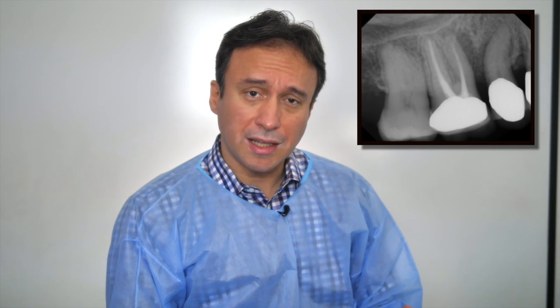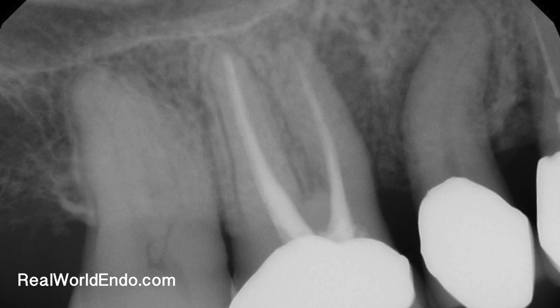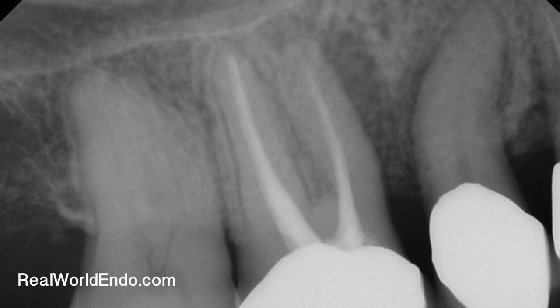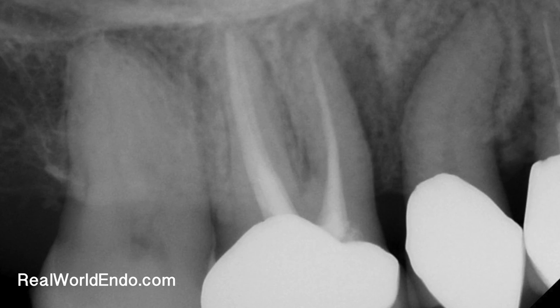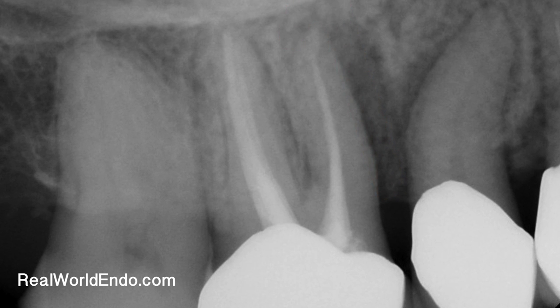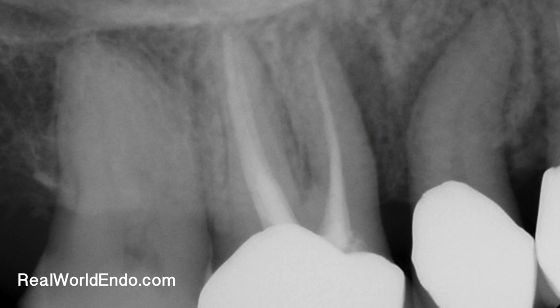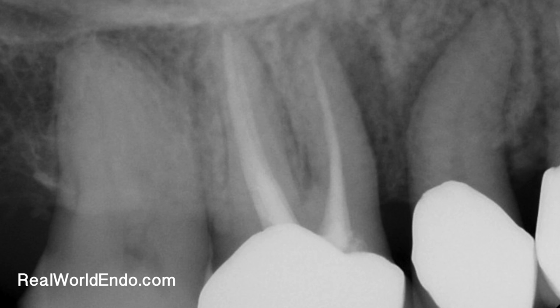Surprisingly, no probing was present when I tested it. No distal buccal and palatal root radiolucencies were also observable on the radiograph, so it seemed to be localized to the mesial buccal root. Whenever I see this long J-shaped type of lesion, I'm always thinking that there is a high chance of a potential root fracture. Keep in mind that this is not a 100% rule, and sometimes a lateral lesion or a sulcular sinus tract can mimic this look.